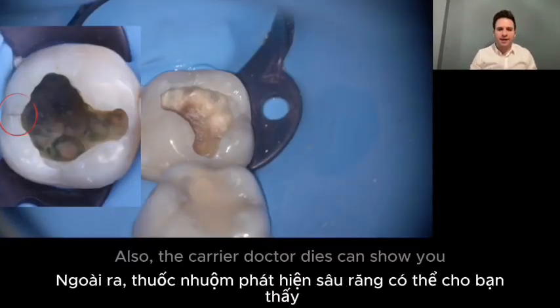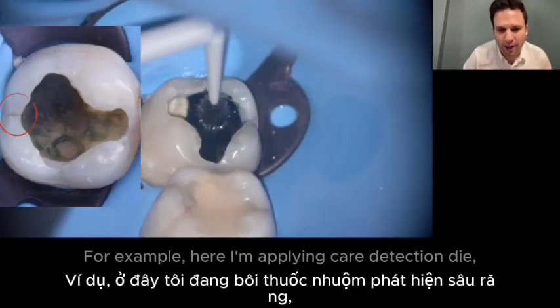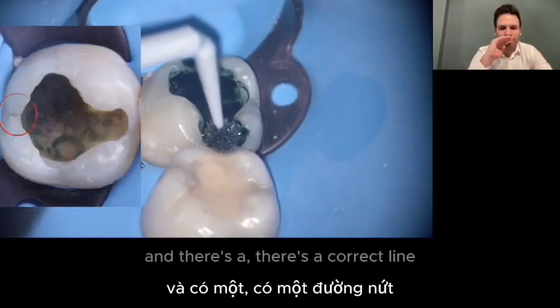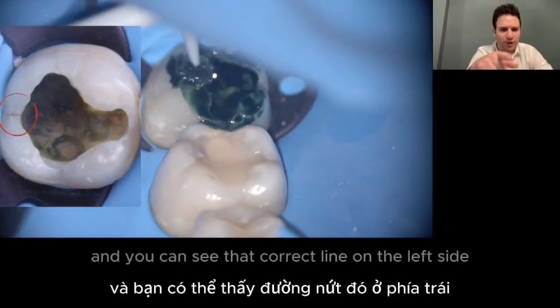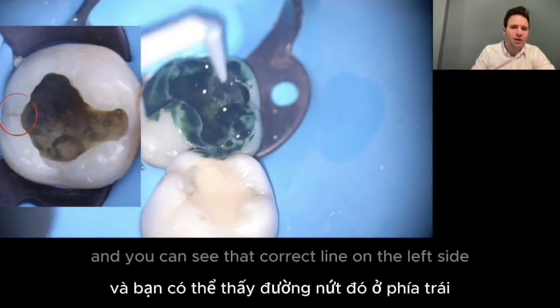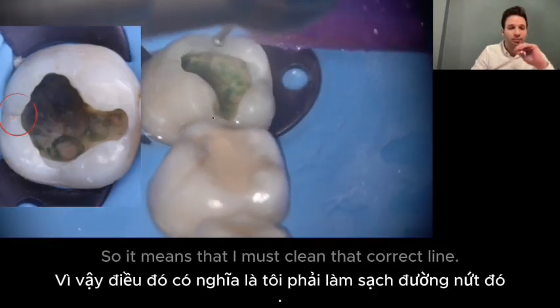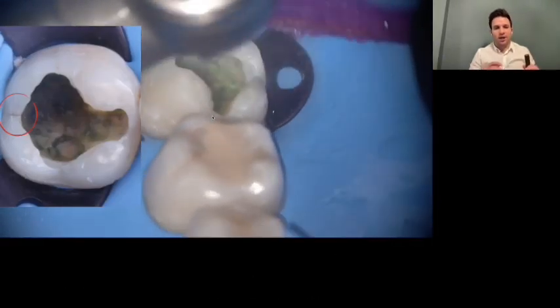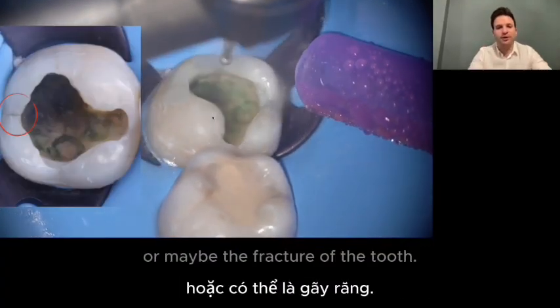Also, caries detector dyes can show you some crack lines. For example, here I'm applying caries detection dye, and there's a crack line on the distal side, which you can see on the left side of the photo here. Here is the crack line, so it means that I must clean that crack line. Otherwise, after direct restoration, we may encounter leakage or maybe fracture of the tooth.